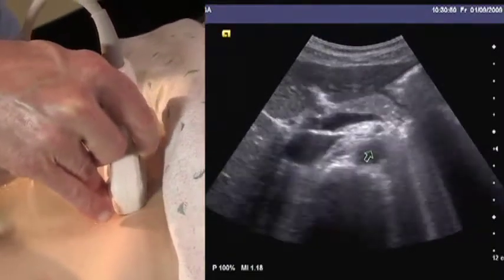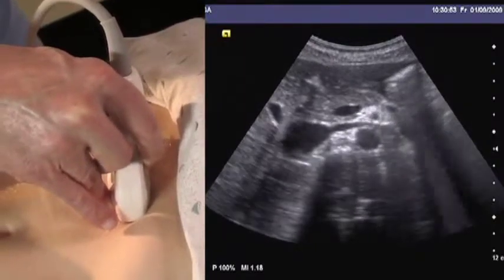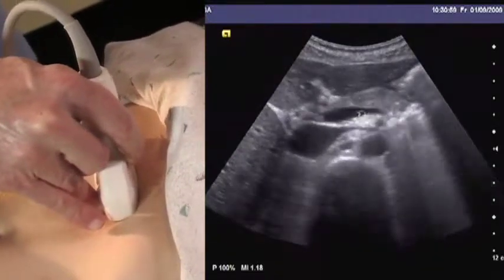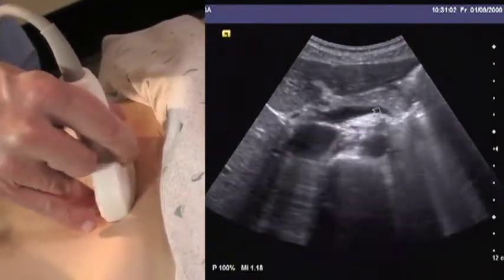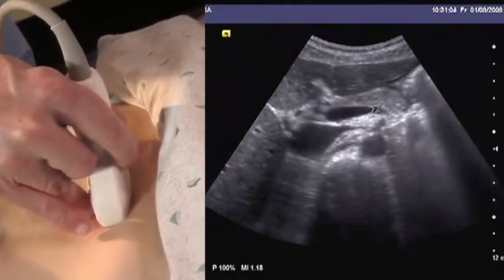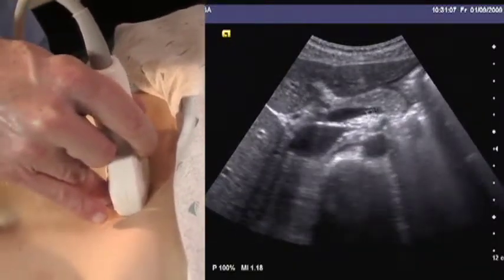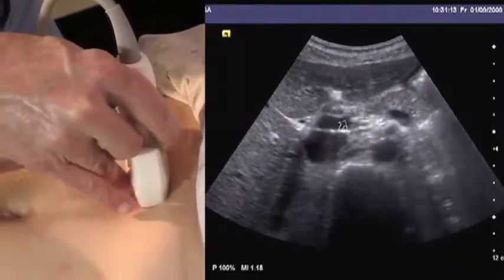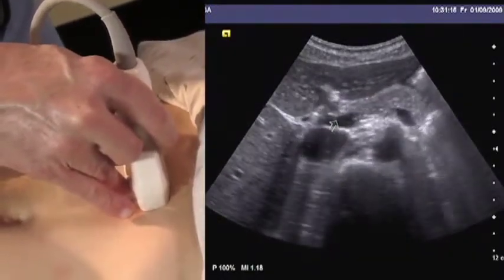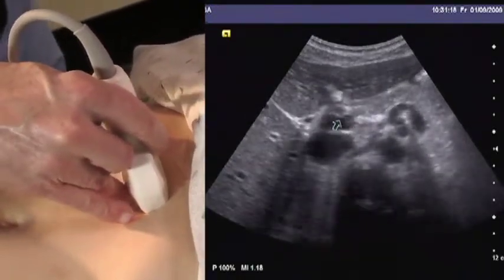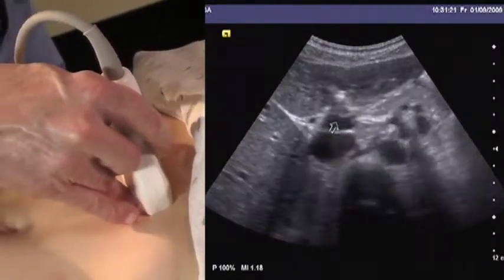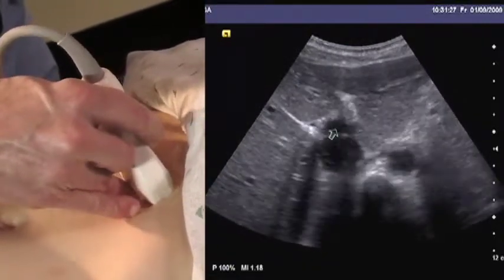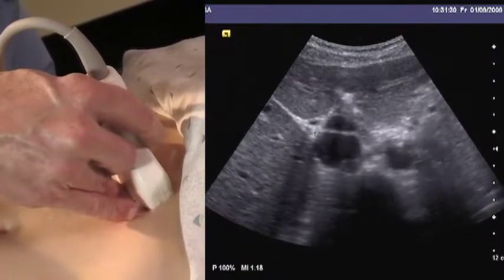Heading further inferiorly, the superior mesenteric artery is surrounded by its characteristic rim of fat. Anterior to the SMA, this vein here is the splenic vein, coming over from the spleen on the patient's left and heading to meet the superior mesenteric vein, which is right here. The two of them form a confluence right here, forming the portal vein. Immediately superior to this, as we head north, the portal vein becomes the dominant vessel.